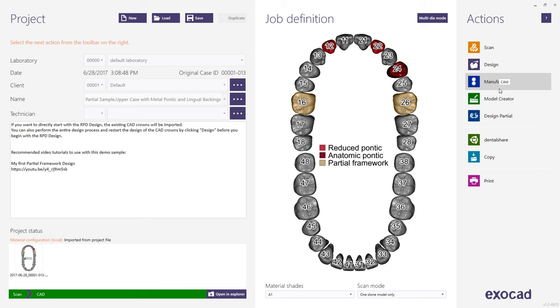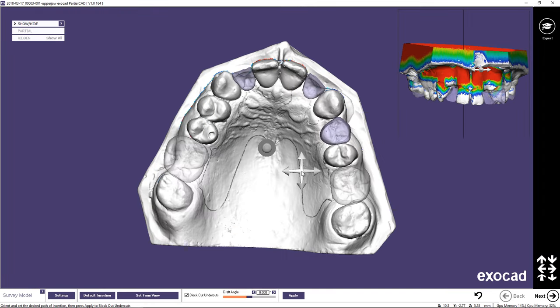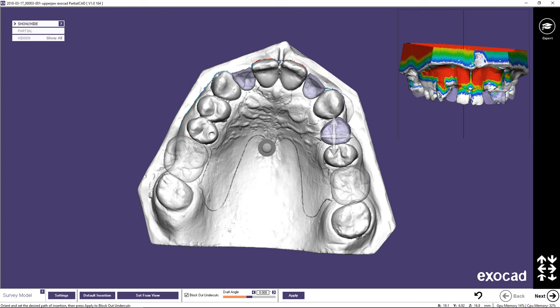Choose Design Partial in the Actions menu. Notice the restorations previously designed are transparent — the visualization teeth appear a grayish color and the all-metal teeth a purple hue. In Partial Design, the wizard is located along the bottom of the screen, with the name of the current step in the left corner and the instructions at the bottom of the menu.